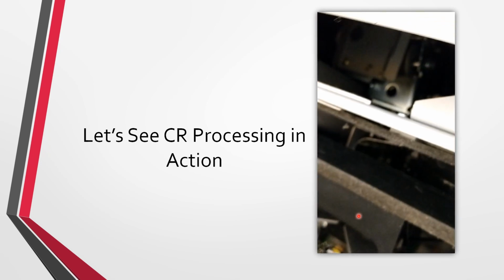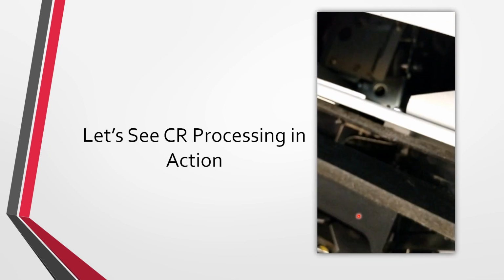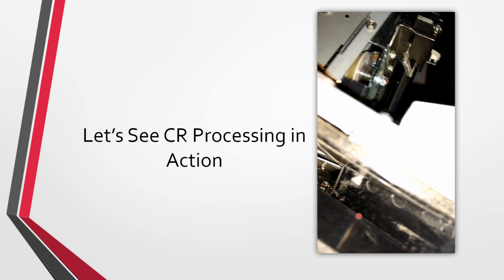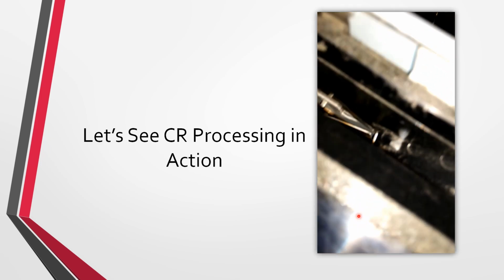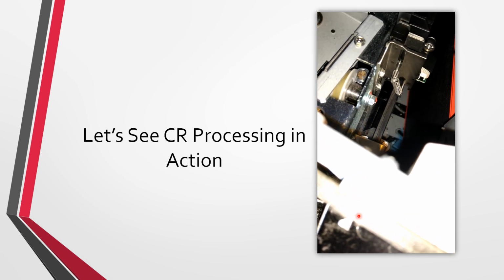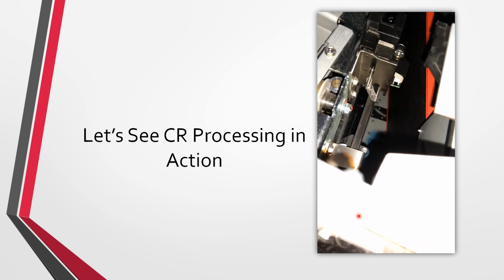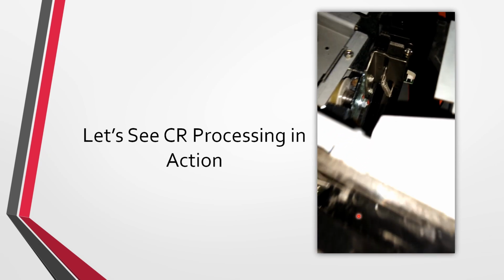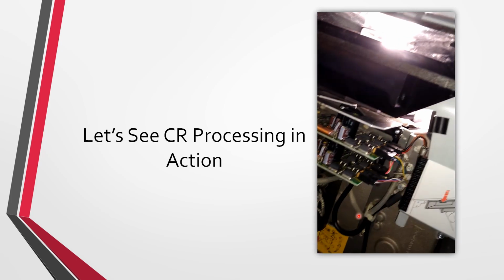The laser light, which is a red light, is going to stimulate the electrons, and then it's going to release, through the PSL process, blue light. That blue light's going to be picked up by the collecting optics. It's going to go to the photomultiplier tube, photodiode, and then the analog to digital converter, then to the computer.